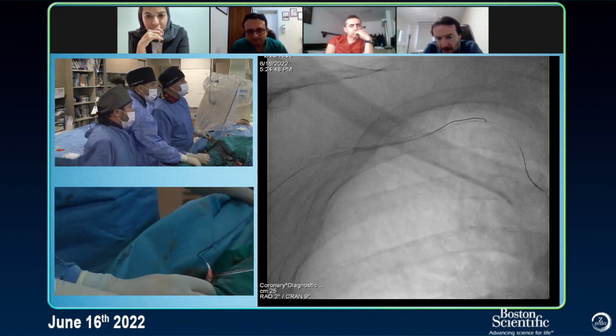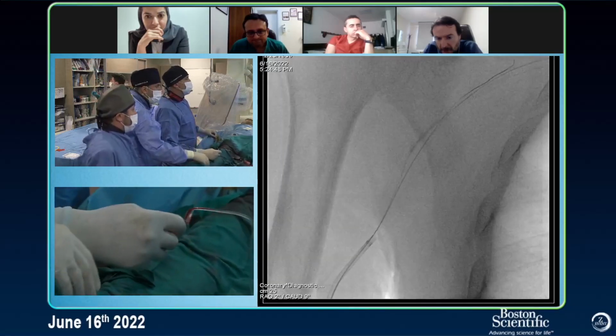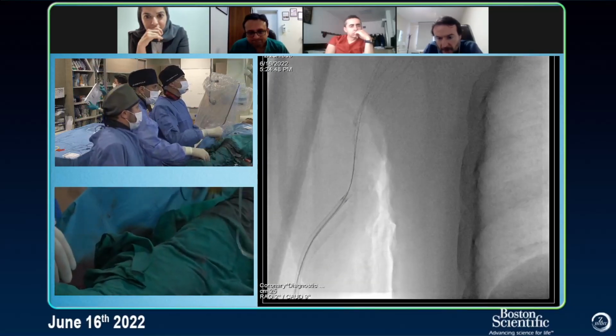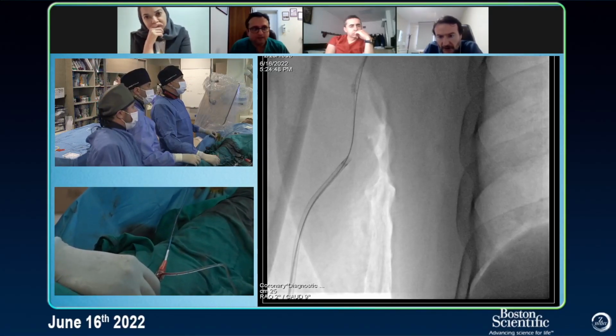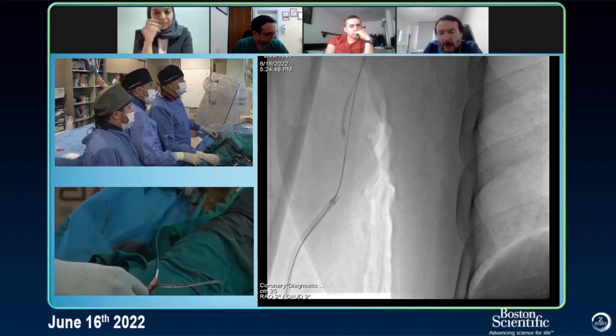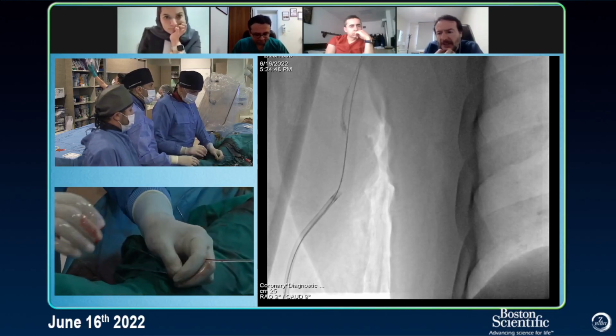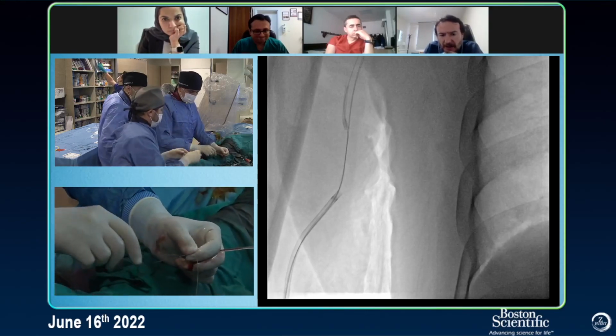I don't think I can have it in my sheath. Right, that is a problem. It's already damaged. So what do we do? I can snare it from here. Yeah, you should snare it. This is a big stent. What's the brand of the stent? Xience? Promus? What is it? Biomatrix. Biomatrix.